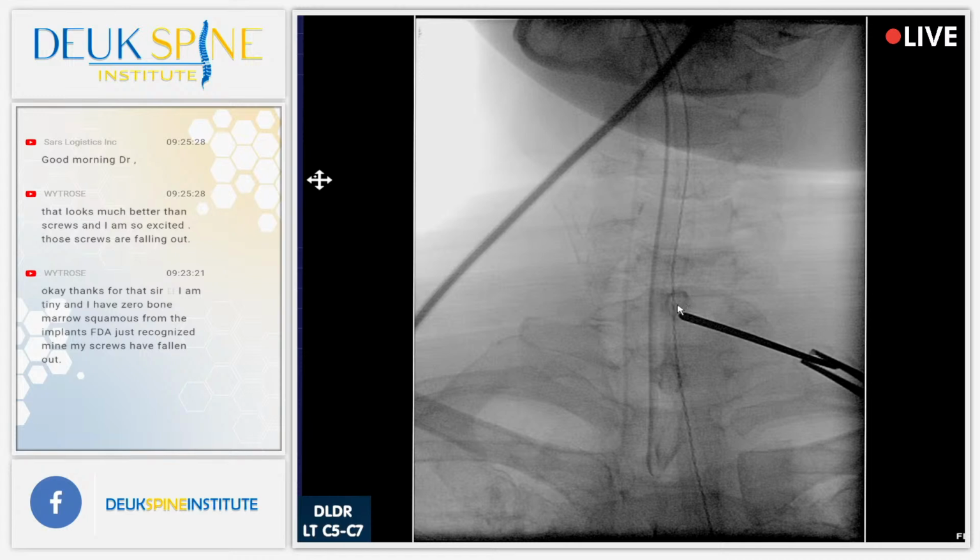Show us the esophageal temperature probe. You see that braided probe? That's the esophagus. All right, notice how it's deflected to the side, right where I'm working. And then show us the endotracheal tube, which goes into the trachea, and where it ends. And show us, yeah, it ends right there, above the carina. All right, lateral view.